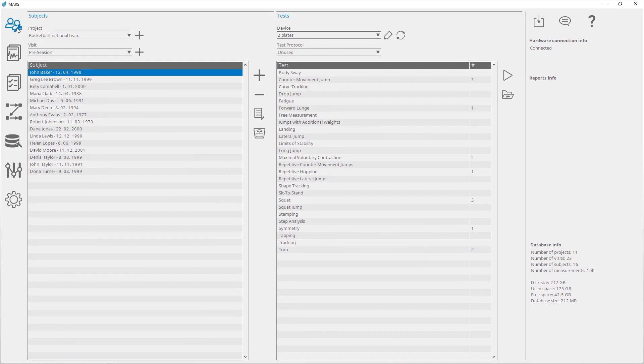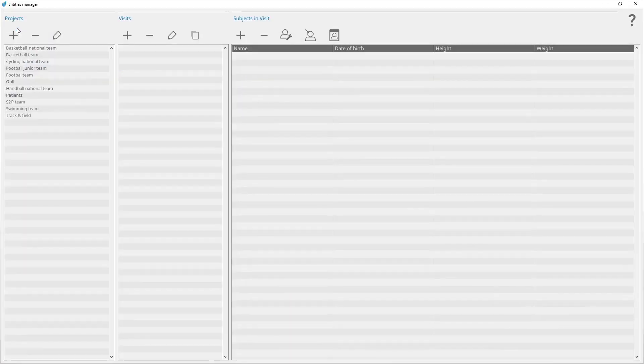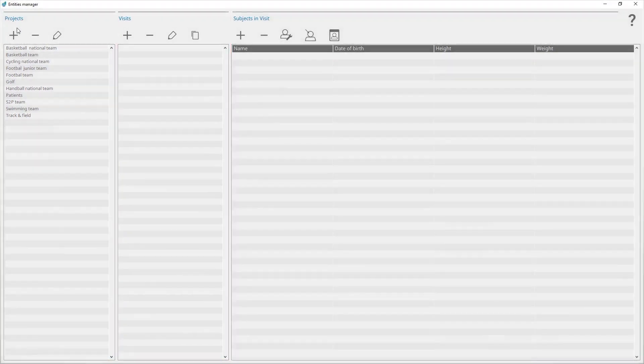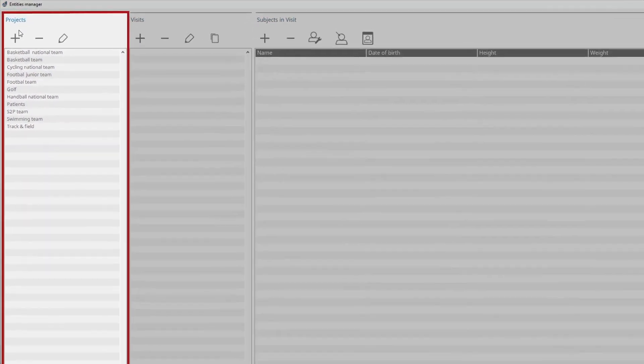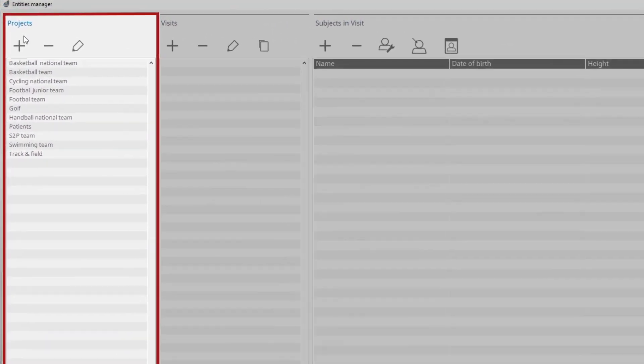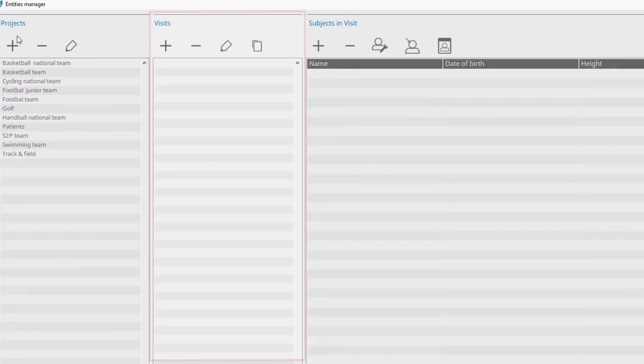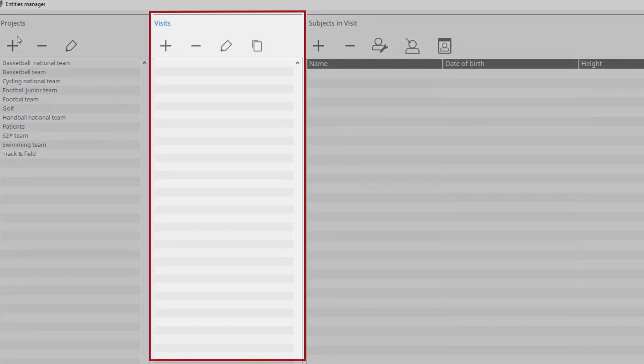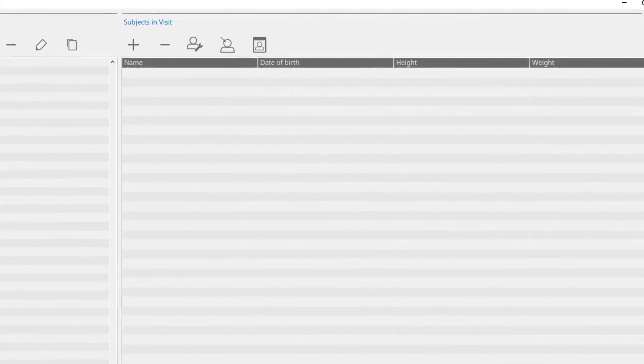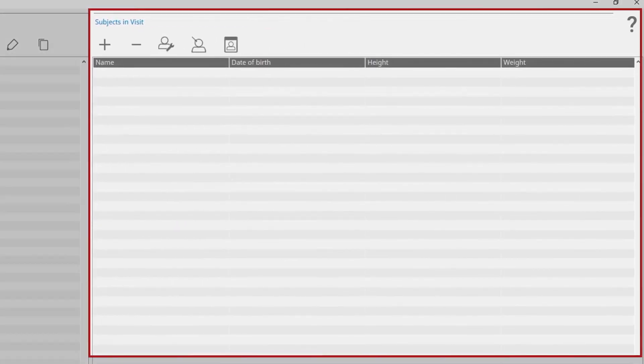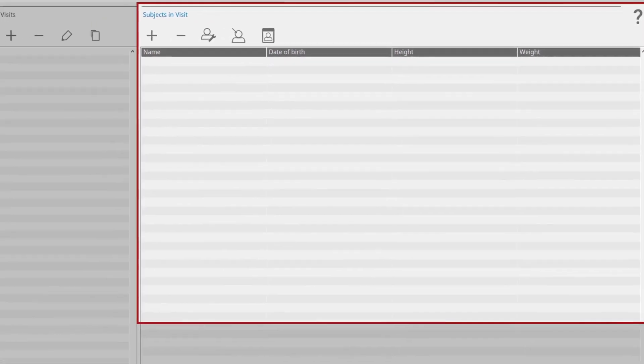The Entities Manager window consists of three panels. In the Projects panel, all created projects are listed. In the Visits panel, all visits of the selected project are listed. And in the Subjects in Visit panel, all subjects of the selected visit are listed.